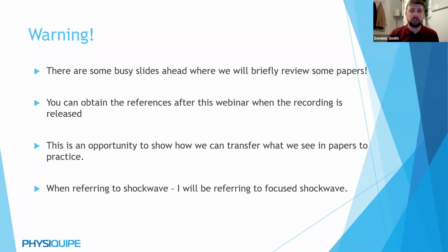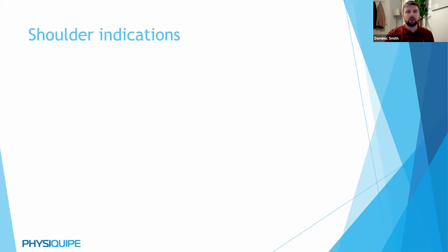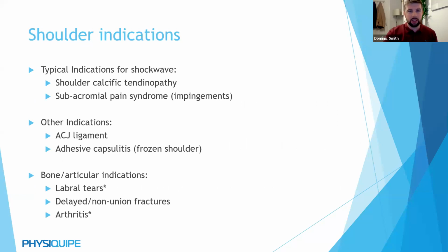But really this is just an opportunity to show a couple of handpicked papers and summarize them into how we could potentially put that into practice. And from here on out, if I'm talking about shockwave, I'm referring to focused shockwave. So first and foremost, shoulder indication. Typical indication, shoulder calcific tendinopathy is pretty much our big one where shockwave is concerned. And we've also got subacromial pain syndrome or impingements, which seems to be quite commonly used.